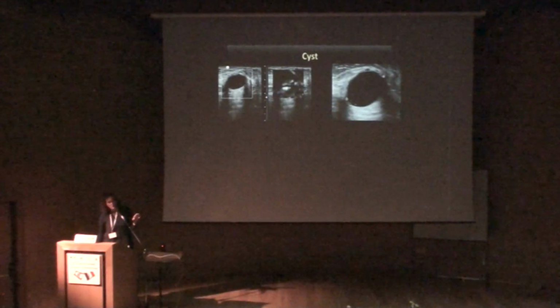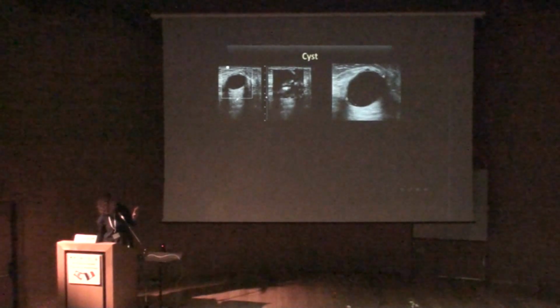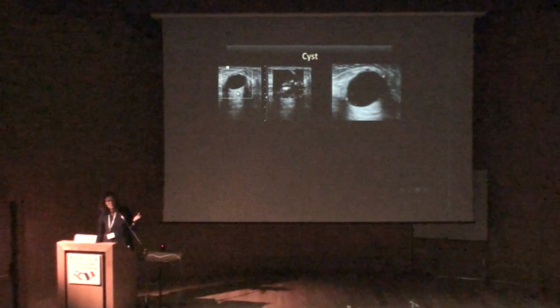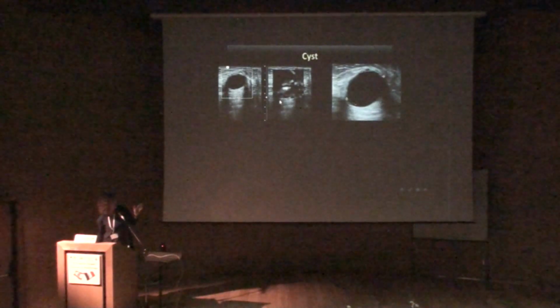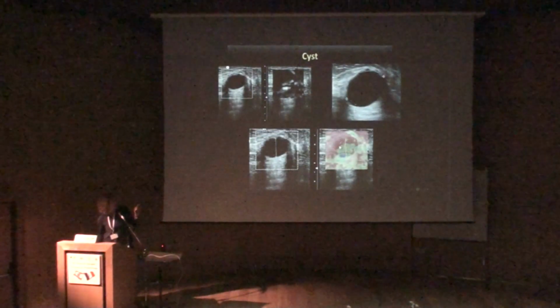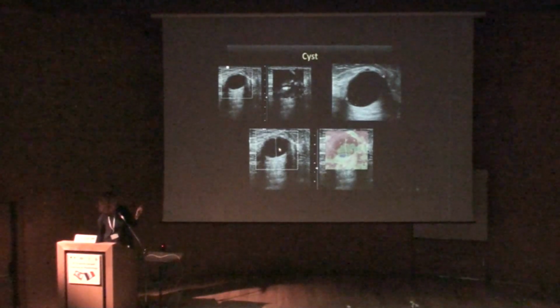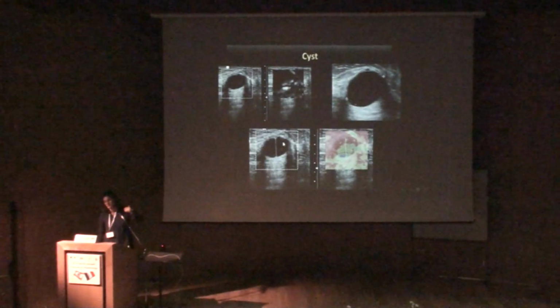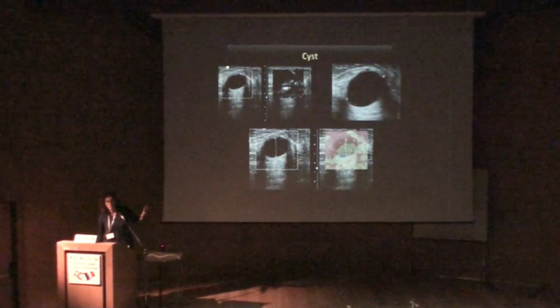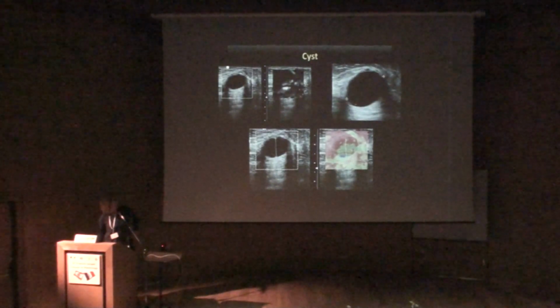In addition, on elastography, cysts have a typical appearance, and sometimes, as in this example, there are some internal echoes and we are not sure whether it is a cyst, so we put the elastography button and there is the typical bull's-eye appearance, or the 3 layers. This is the typical artifact in the static elastography, and when I see it, I know it is a cyst and not the cancer that I missed the first time. So we use it very frequently. It's simple, it works very fast.